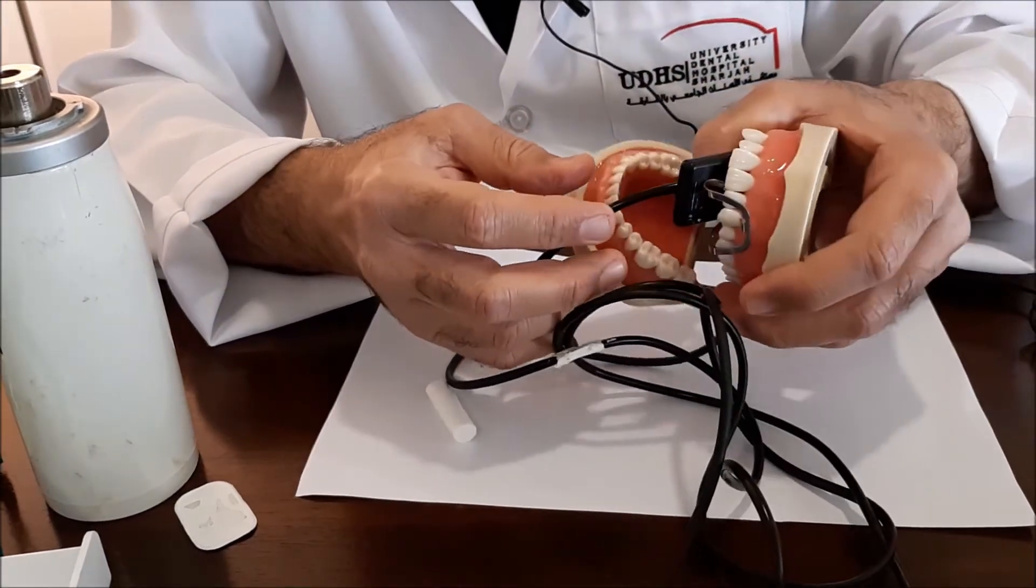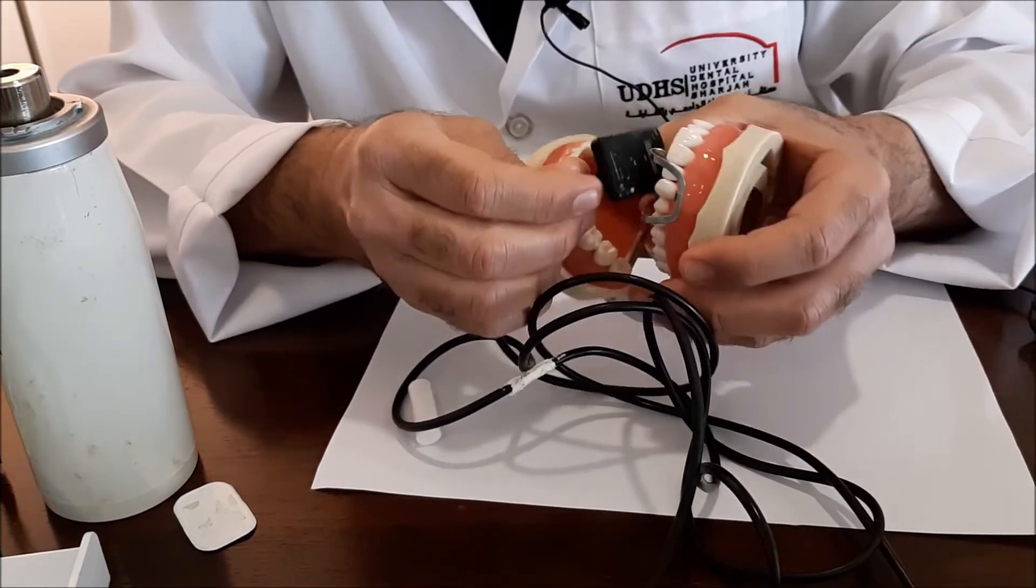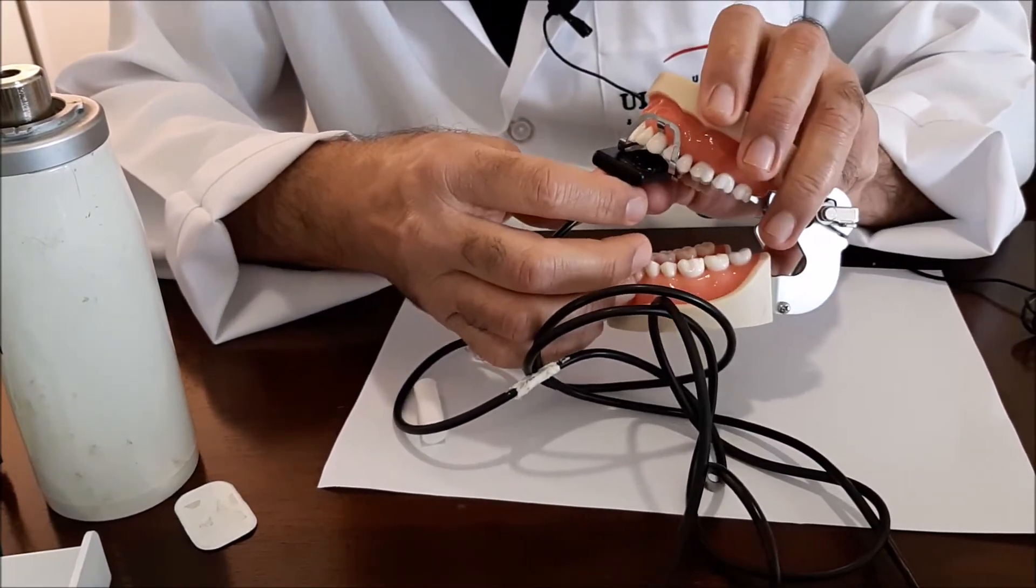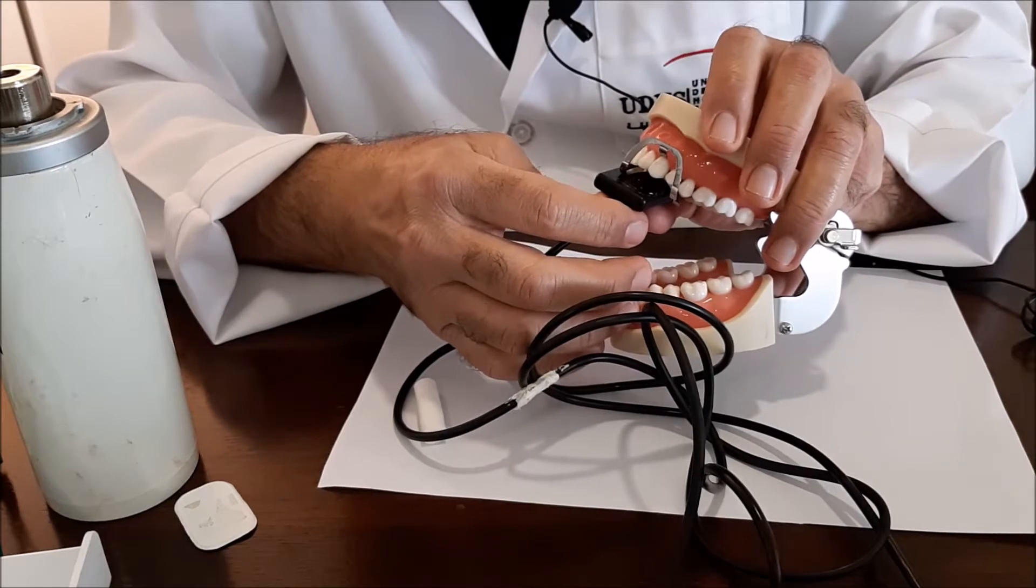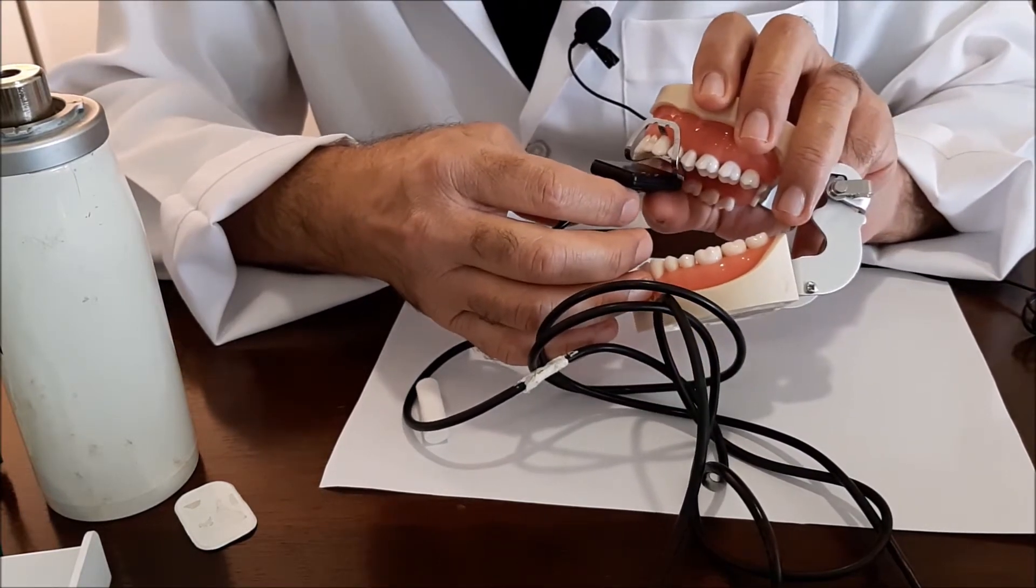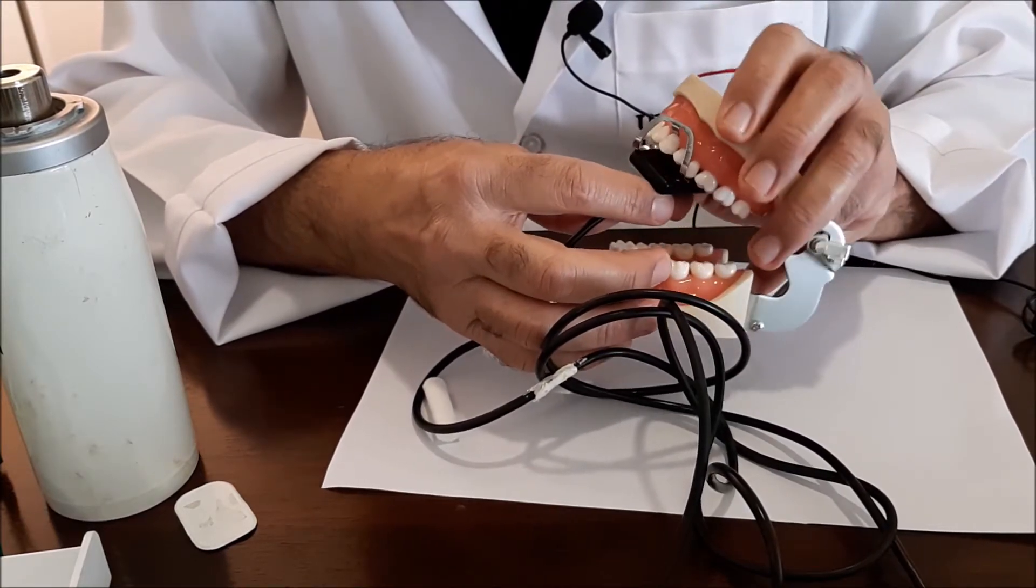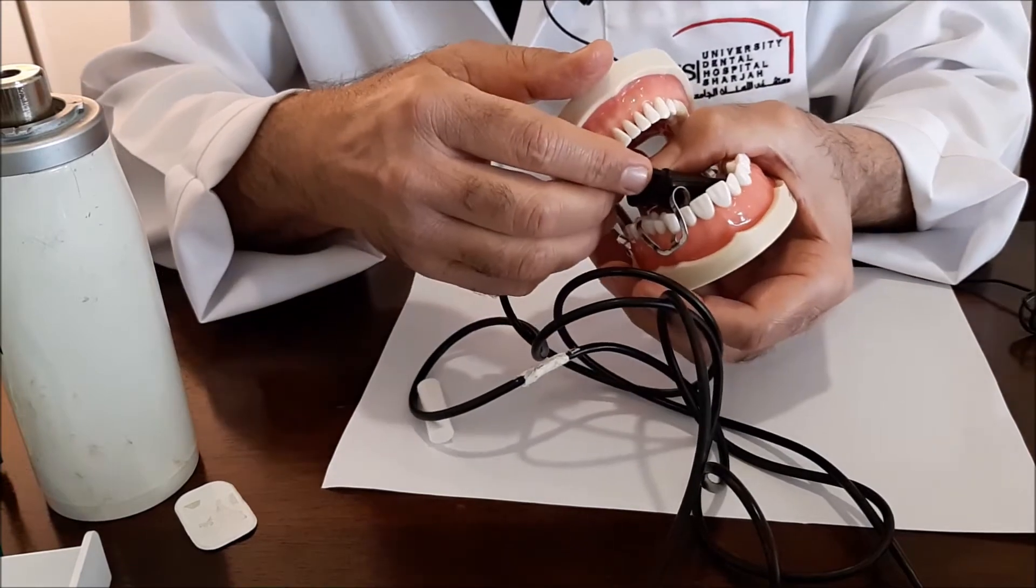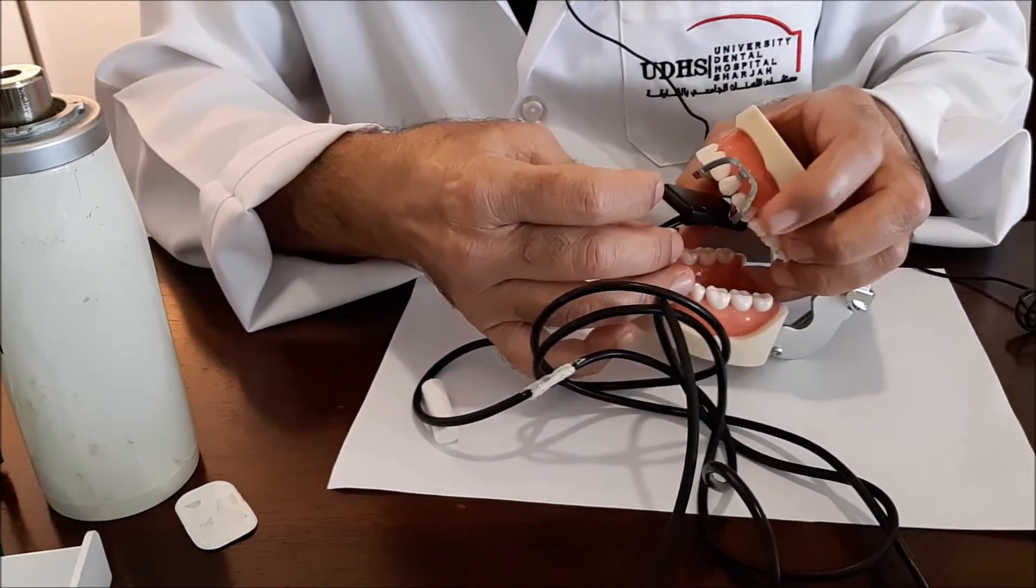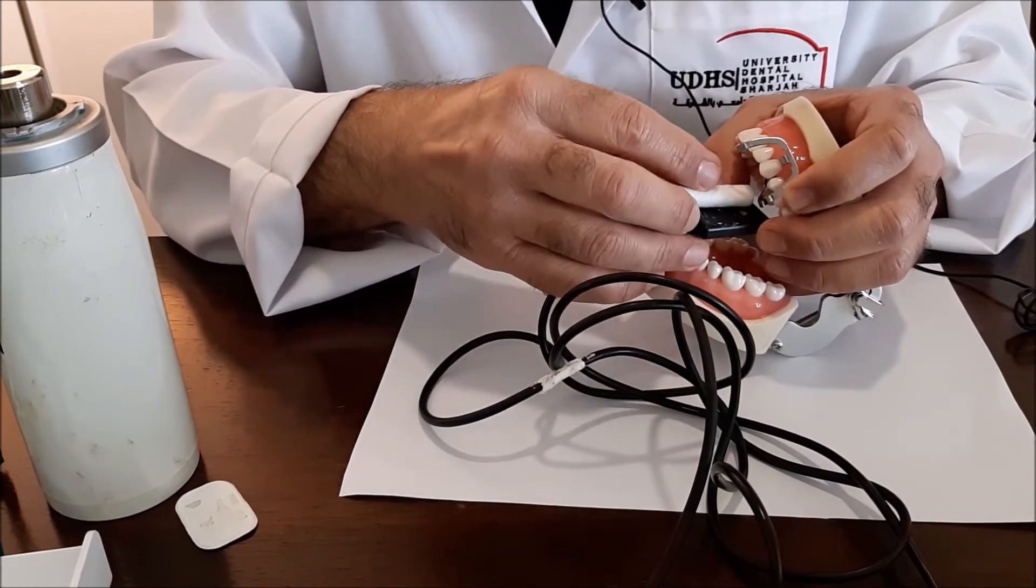If you fail to do so and place the sensor in this way, definitely you will miss the root. So you push as much as you can backwards, and preferably you use the cotton roll.